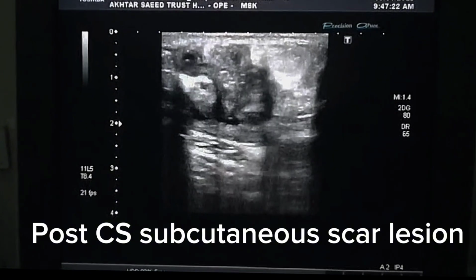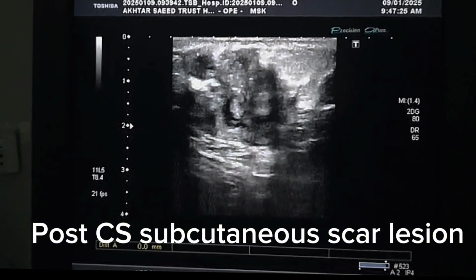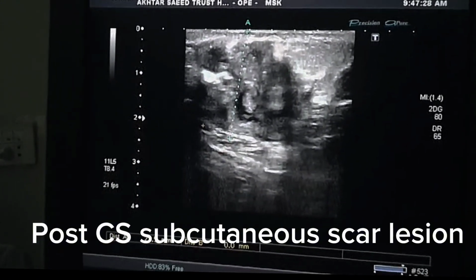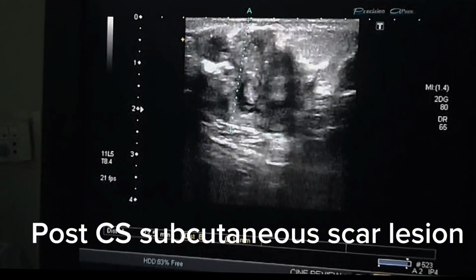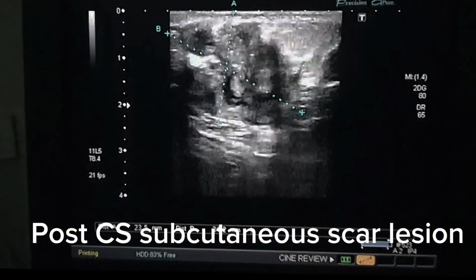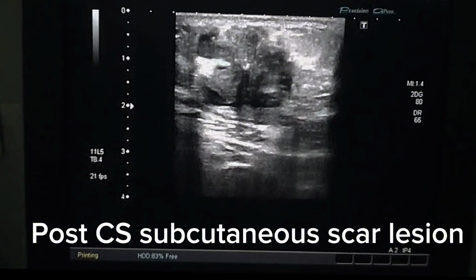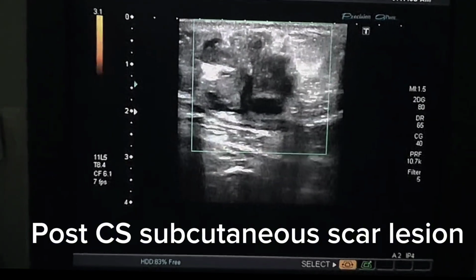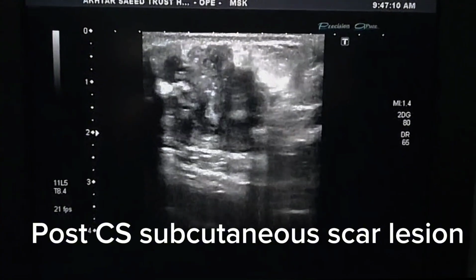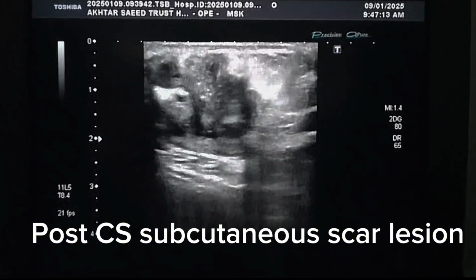Multiple echogenic foci are seen, and these may indicate gas, suggesting infection, calcification, or fat component. We can also visualize debris in this mass, which suggests necrotic tissue, pus, or blood clot. This mass has ill-defined margins and may indicate infection or inflammatory changes. Doppler flow shows minimal vascularity. Posterior acoustic shadowing can also be visualized, and this may be due to calcifications, foreign body, or dense fibrosis.